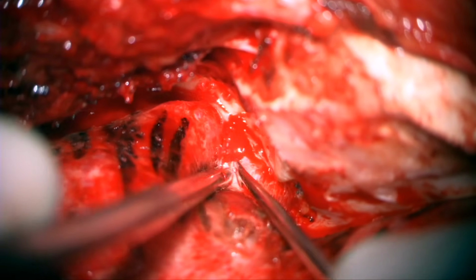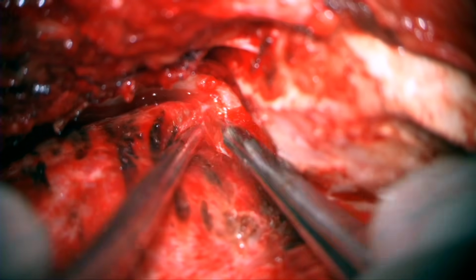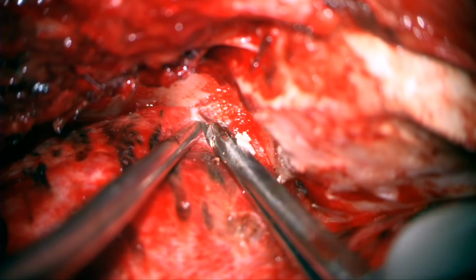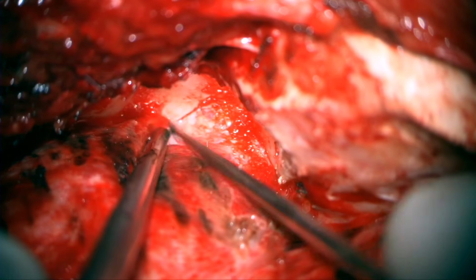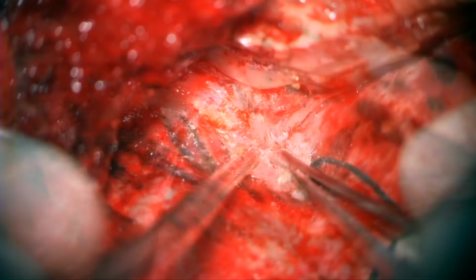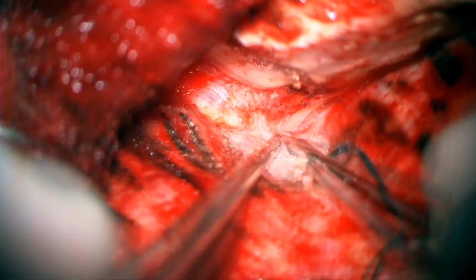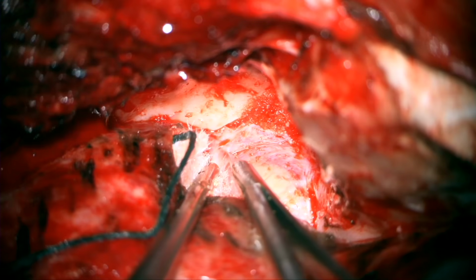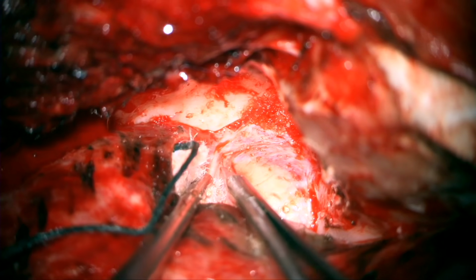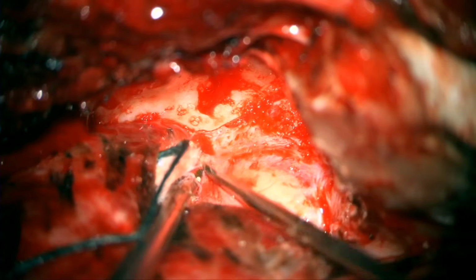We continue dissecting this dura down to the level of V2. Usually there are dural attachments that need to be transected with scissors at this level. Once we liberate those dural attachments, we can continue our peeling of the dura of the temporal lobe away from the cavernous sinus wall. We can now see the whole body of the anterior clinoid process, and now we're along the middle cranial fossa, dissecting along V2, which can be seen displaced by the tumor mass.